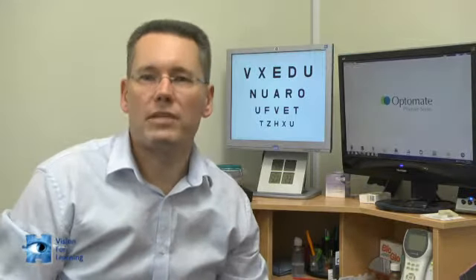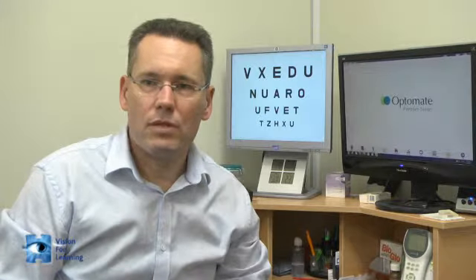Once a student has completed the test, then you can try holding the clear lenses in front of their eyes and asking the student to look out the window into the far distance, ideally more than 6 meters away, perhaps at a sign or some writing on the wall. And with the lenses in front, ask them if the writing looks blurry.